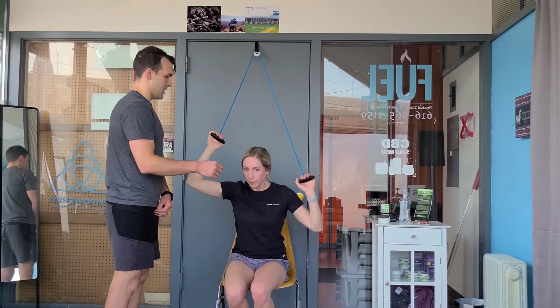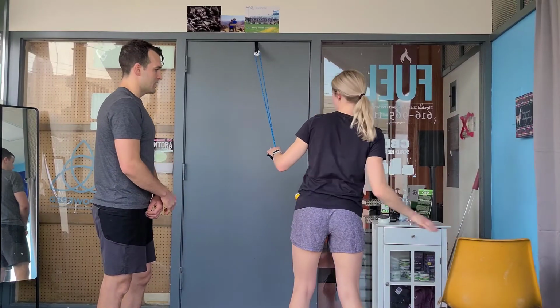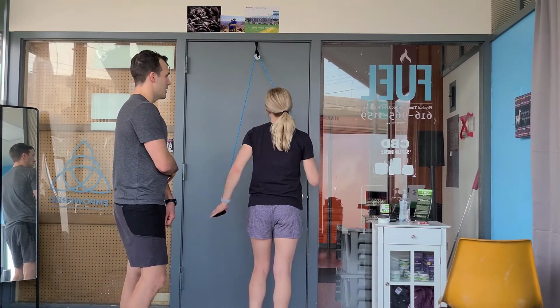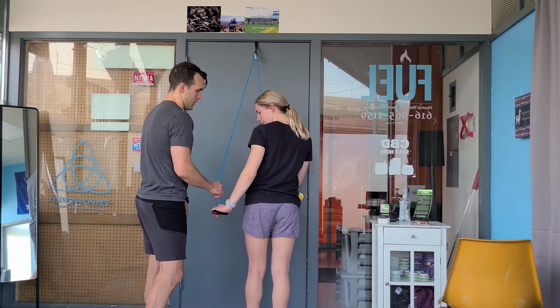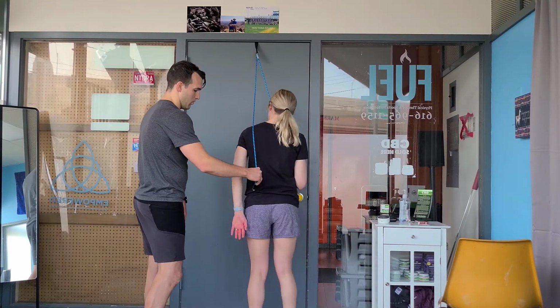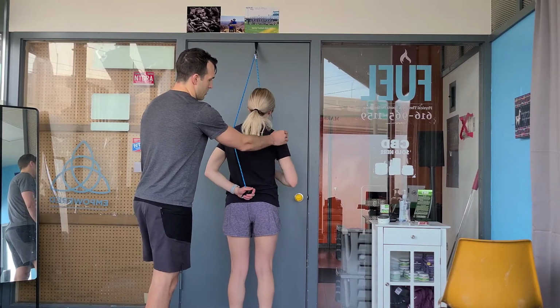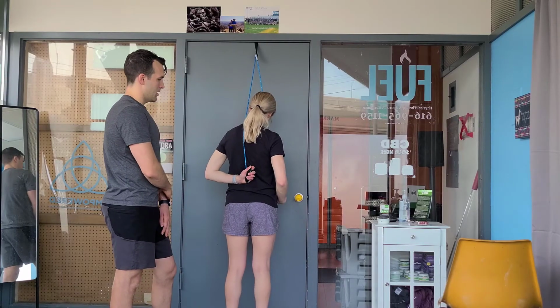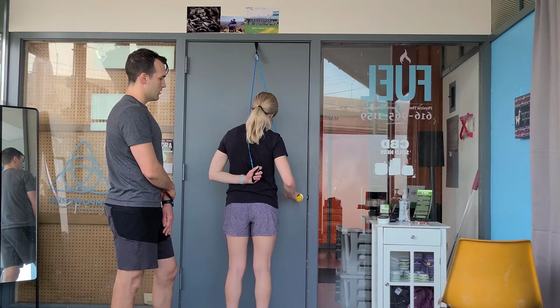I think go ahead and stand, and then if we face the door, that way you can see how the pulleys are set up. We'll do facing the door and then facing the camera, so you can see both. But you might need someone to help you. If you want to bring this, so if it's this arm we're trying to do behind the back, put it over like so, and then she can grip on, and now she's going to use this arm to pull down, and then this arm's going to get pulled up by that pulley. Good.